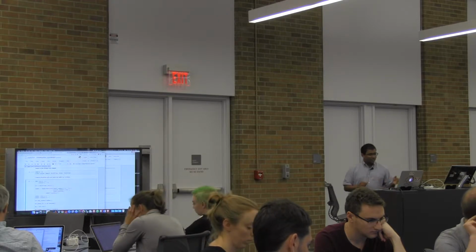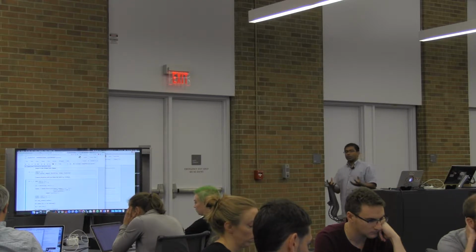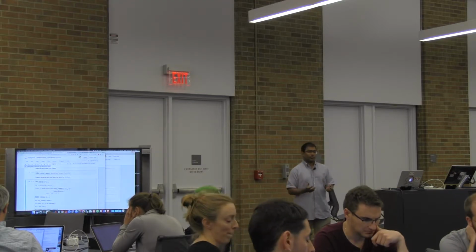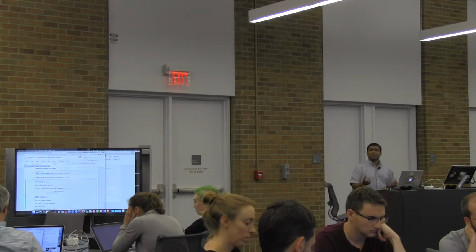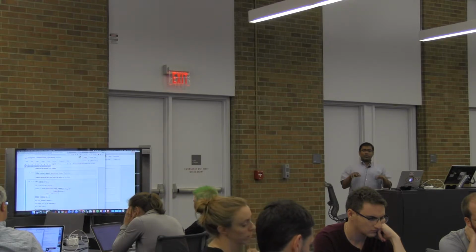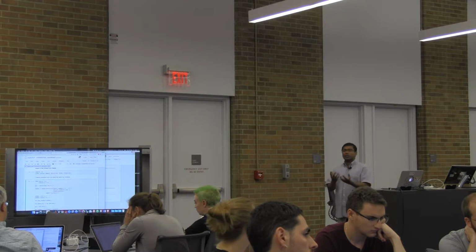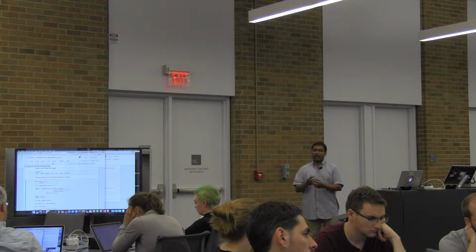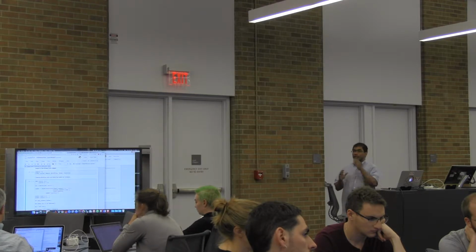Okay. So workflow, we've called it hello, and then we create this construct called node. So we are wrapping an interface in a node. That's a distinction that's important conceptually: we have interfaces, which you can run and use as described on the help page, and they run literally directly on the shell that you're in. A node creates a working directory for an interface and encapsulates all its outputs within that working directory. So it creates a layer around an interface to create isolation.